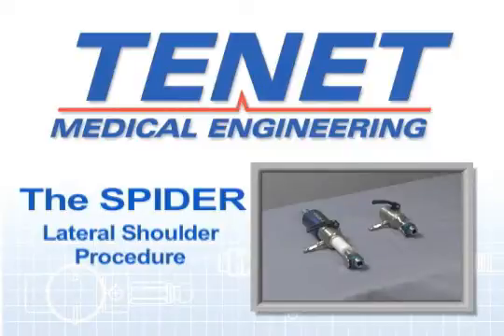Before the lateral shoulder surgery, the piggyback, lateral shoulder bar, and traction accessory must be autoclaved.